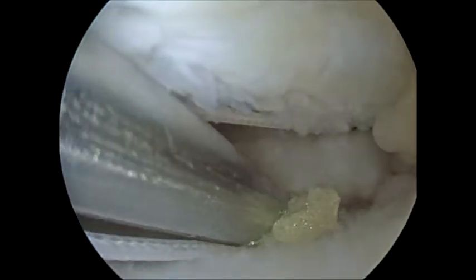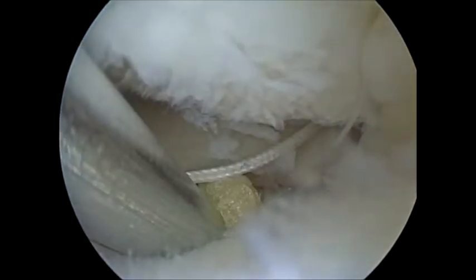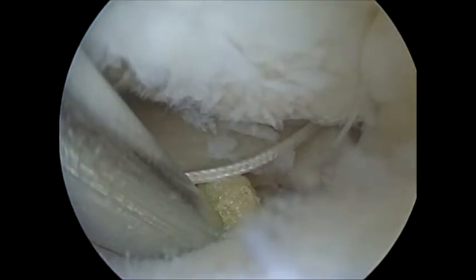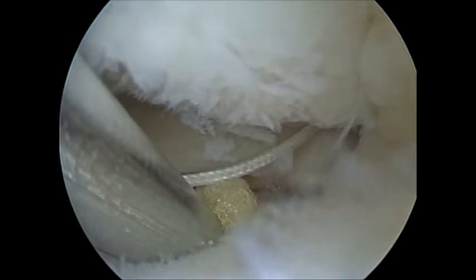For the third part, applying the soft anchor suture from the far anteromedial portal at the footprint of the torn meniscal root.